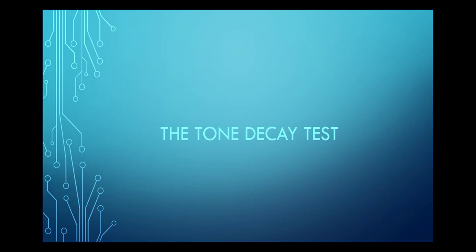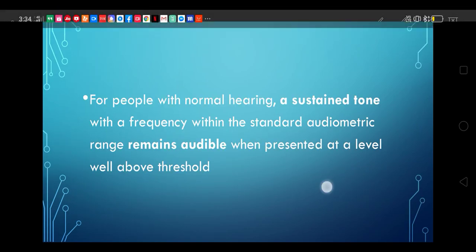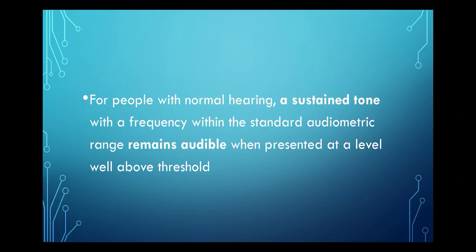The tone decay test. For people with normal hearing, a sustained tone with a frequency within the standard audiometric range remains audible. I repeat, a sustained tone remains audible when presented at a level well above threshold. The key word here is it remains audible.